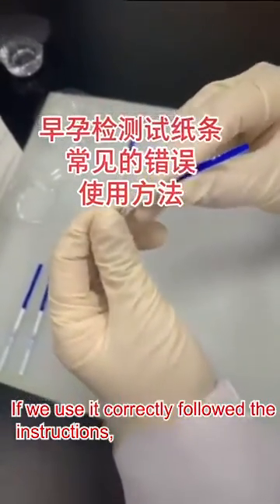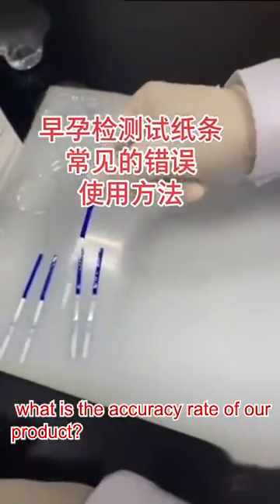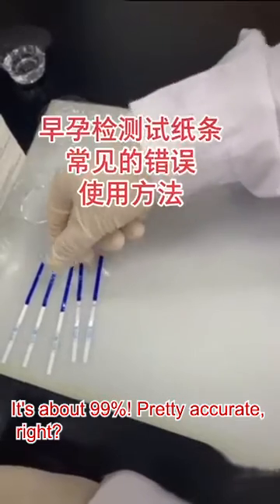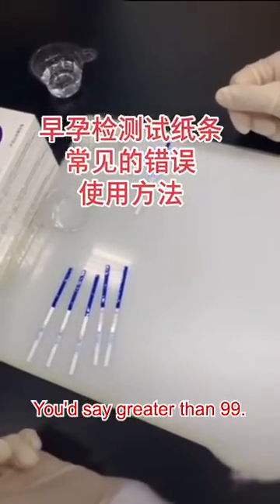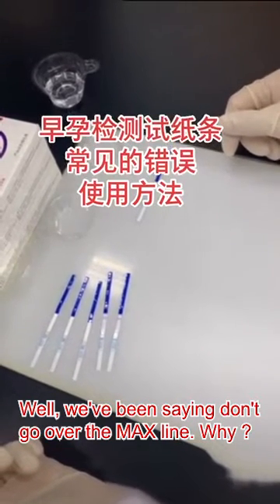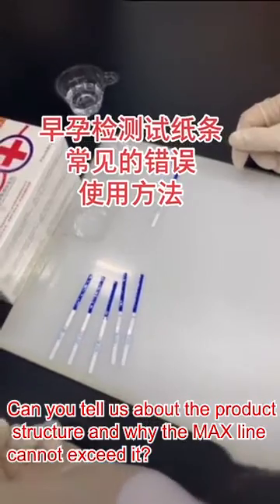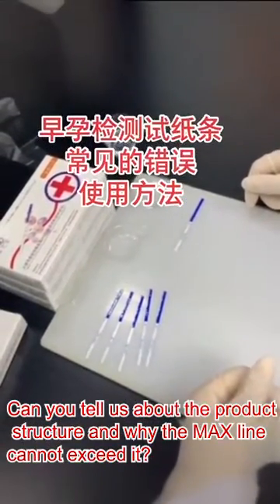If we use it correctly, following the instructions, what is the accuracy rate of our product? It's about 99%. Pretty accurate, right? You'd say greater than 99. Well, we've been saying don't go over the max line. Can you tell us about the product structure and why the max line cannot be exceeded?